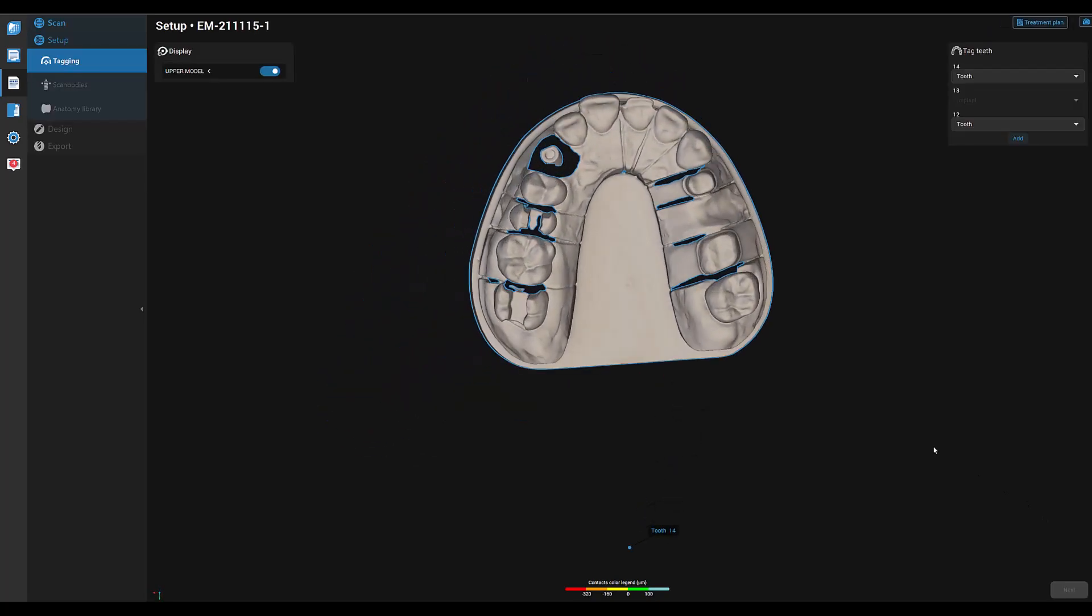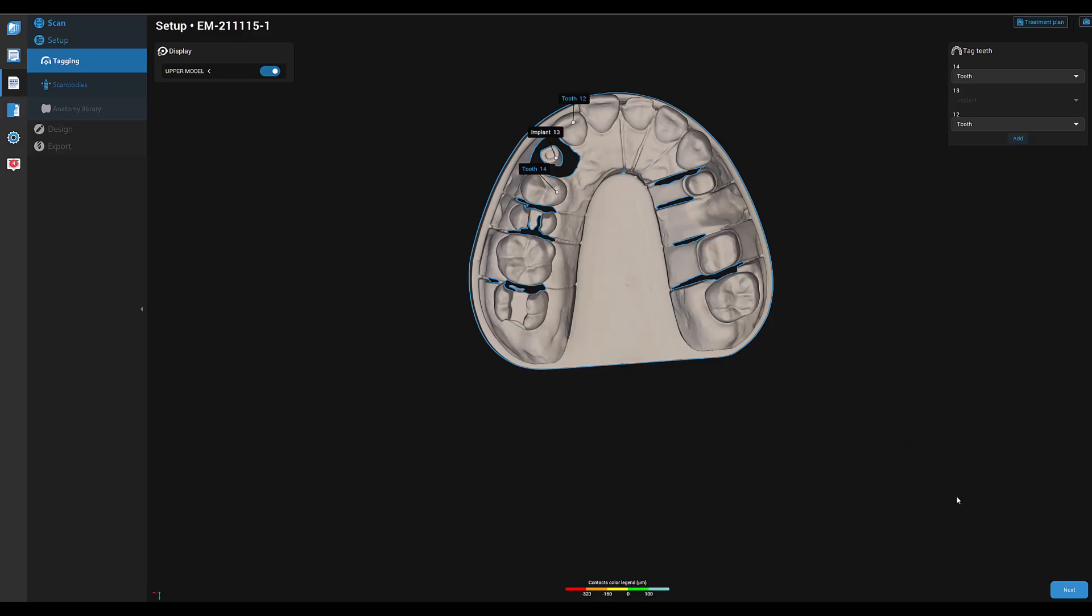Now we do the alignment. We start with the neighbor tooth, followed by the implant, and then the second neighbor tooth.